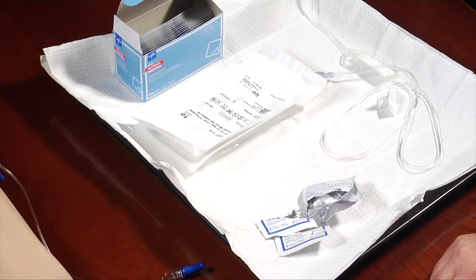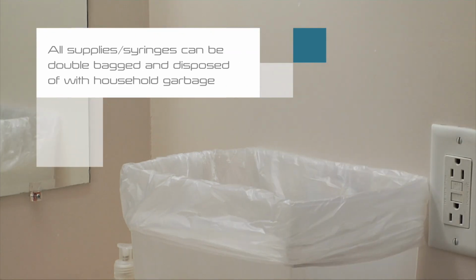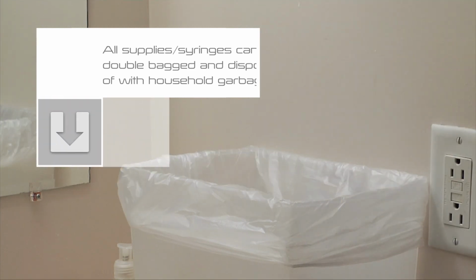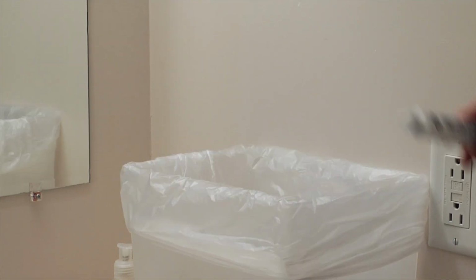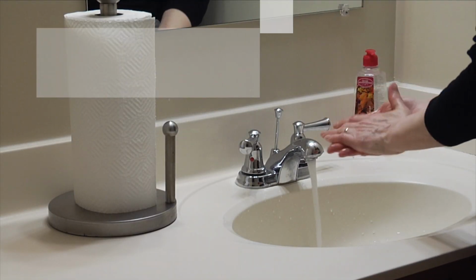All supplies and syringes can be double bagged and disposed of with your household garbage. Make sure to wash your hands thoroughly.